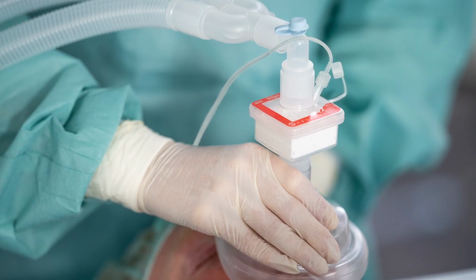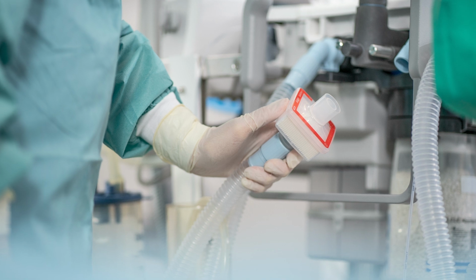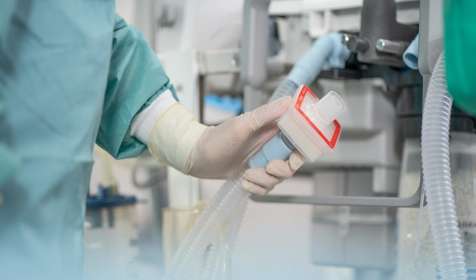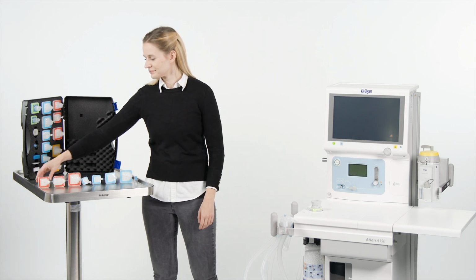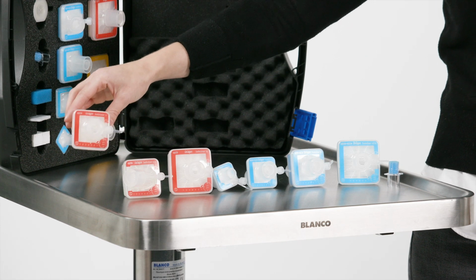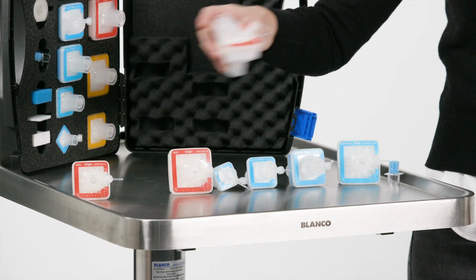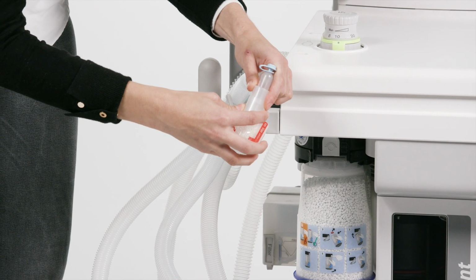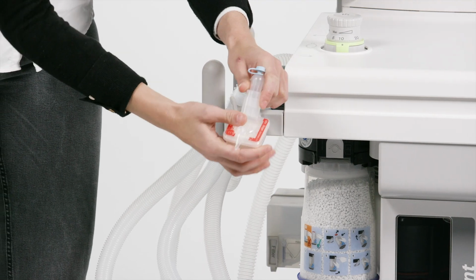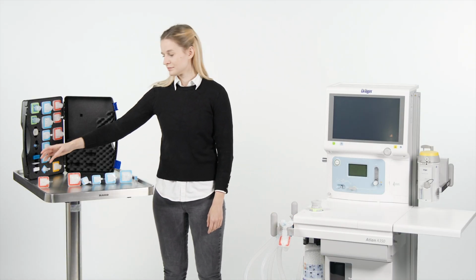The use of low-flow anaesthesia results in heating and humidification of the ventilation gases and therefore requires other filters or combined products. For adult patients, it is recommended to use a SafeStar 55 Plus or a SafeStar 60A Plus on the Y-piece, and optionally a SafeStar 55 Plus or 90 Plus mechanical filter on the expiratory port. A mechanical filter at the inspiratory port would lead to increased condensate formation.